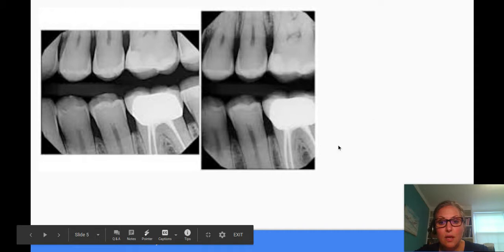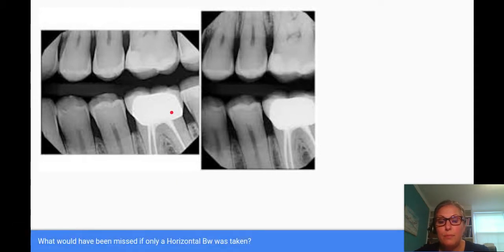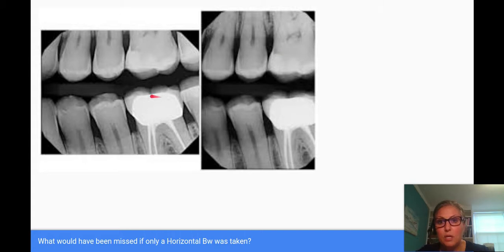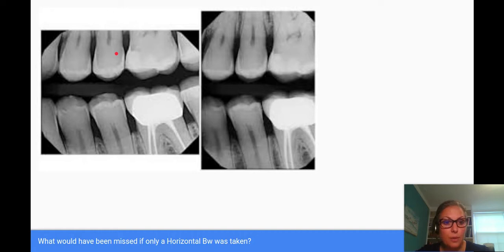Take a look at these x-rays. What would have been missed if only a horizontal bitewing was taken? If we take a look at this premolar x-ray, we would also take a vertical bitewing showing just the molars. But take a look — we would have missed this bone height right here, the true bone height, if we had just stuck to the horizontal bitewing.